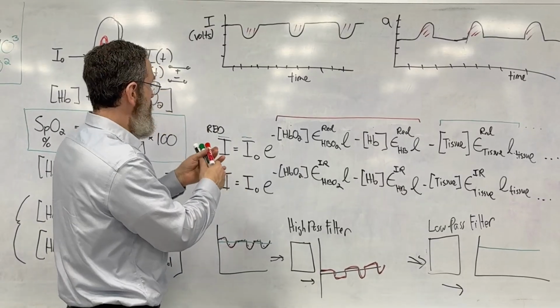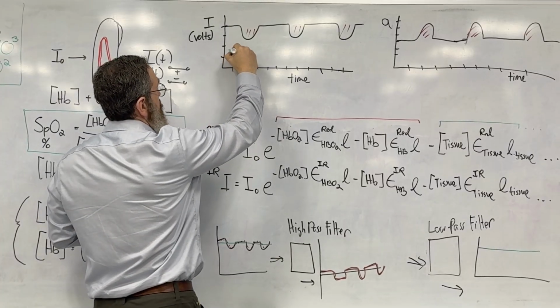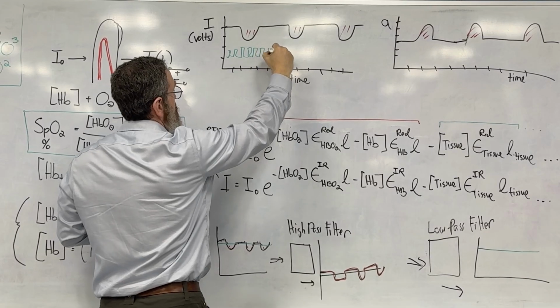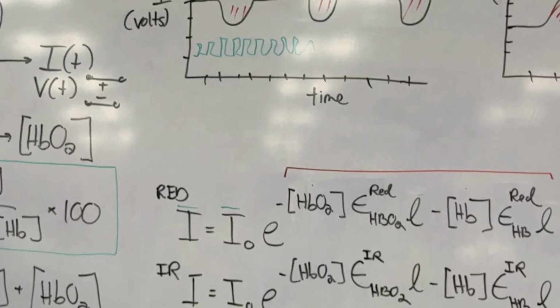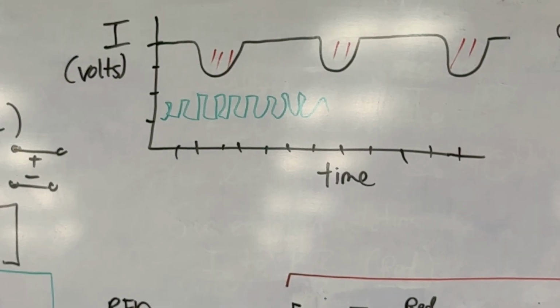So in reality, the light is really flashing like this, tick, tick, tick, tick, tick. And in fact, guess what? Red, infrared, red, infrared. So it's very convenient. You just take turns. Red, infrared. And that's what you'll see here.